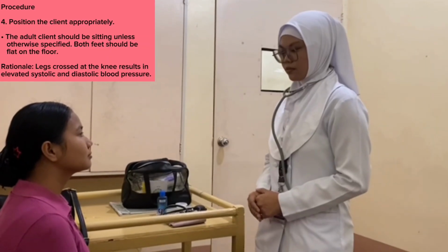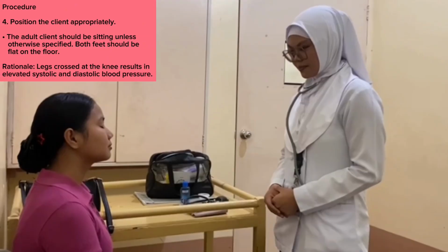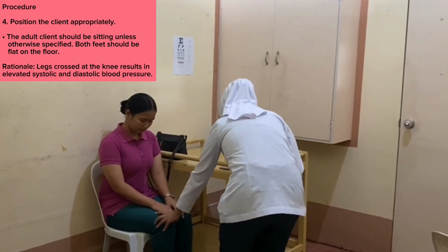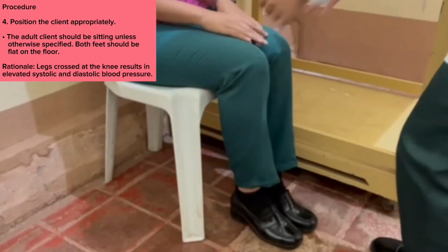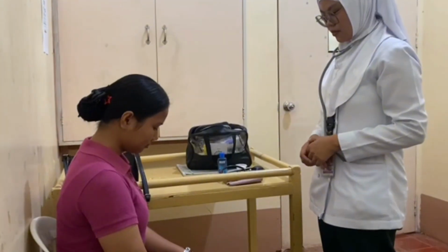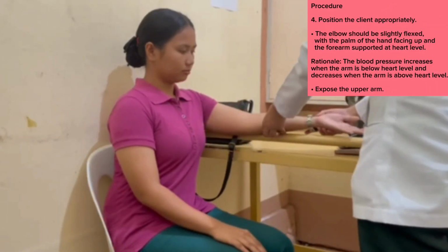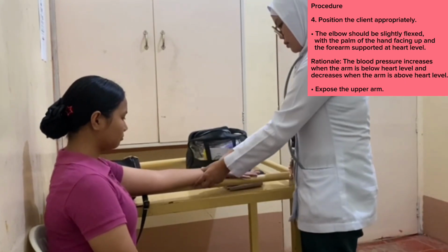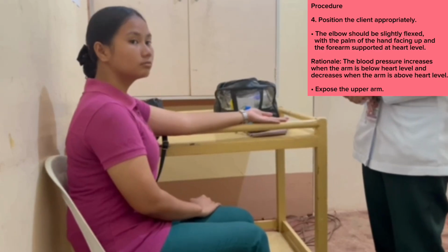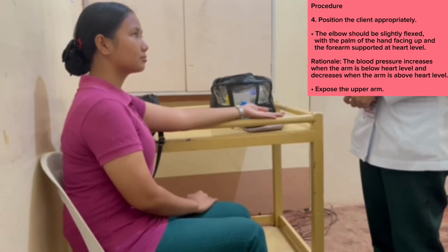Number 4, position the client appropriately. The adult client should be sitting unless otherwise specified. Both feet should be flat on the floor. Rationale: legs crossed at the knee results in elevated systolic and diastolic blood pressure. The elbow should be slightly flexed with the palm of the hand facing up and the forearm supported at heart level. Rationale: the blood pressure increases when the arm is below heart level and decreases when the arm is above heart level. Then, expose the upper arm.